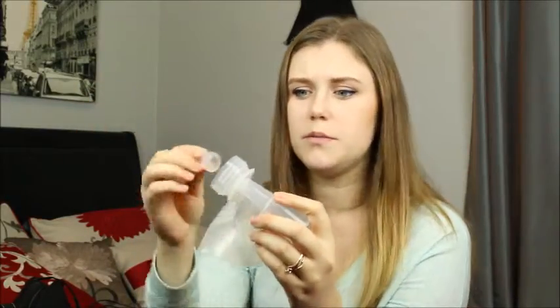Assembly of the Ameda pump is actually very simple. I haven't assembled any other pumps, so I don't know how they work, but you have this flange here. It comes with a little rubbery tip that goes onto one end, the end that connects to the bottle. So this is where the milk flows into the bottle. It flows through this. So it just goes on there, very easy. Bottle screws on just like that. There is a little rubbery, I don't know, cup, I guess you call it, and it goes right into the very top, just like that, and that's doing the pumping.